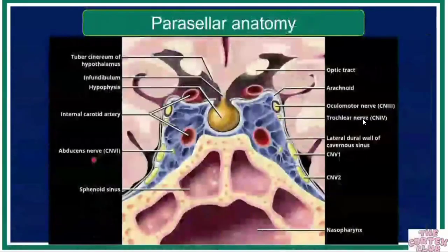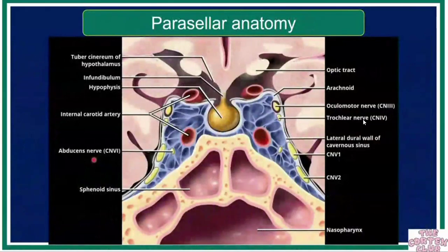All right, so we talked about the anatomy of the sella, what the gland looks like normally on normal T1 and post-contrast T1 weighted images. What is the normal size of the pituitary? When do we say it is pituitary hyperplasia? When it's increased in size, diffusely enlarged with a midline stalk. We talked about what an empty sella looks like. These are normal variants. And then we talked about the ectopic position of the posterior pituitary gland in cases of kids who have diabetes insipidus.